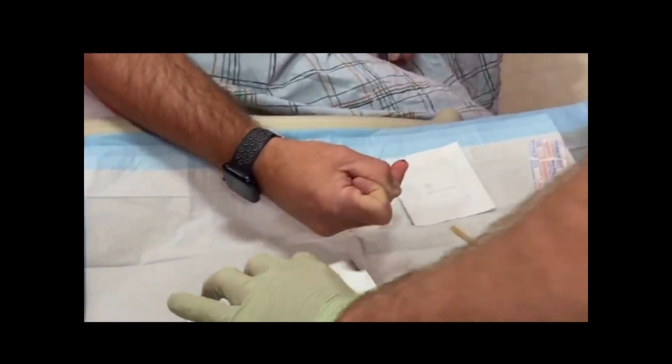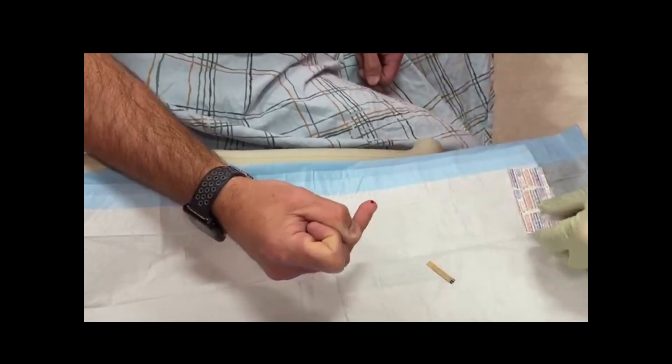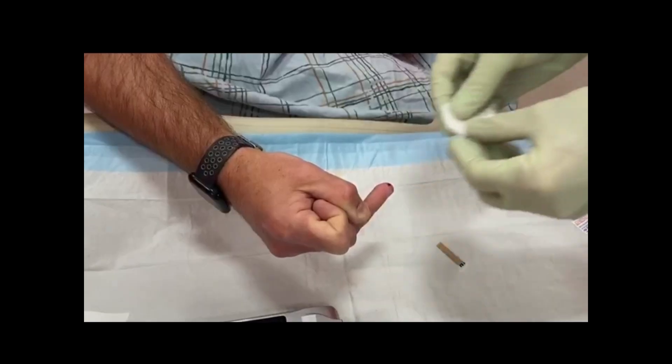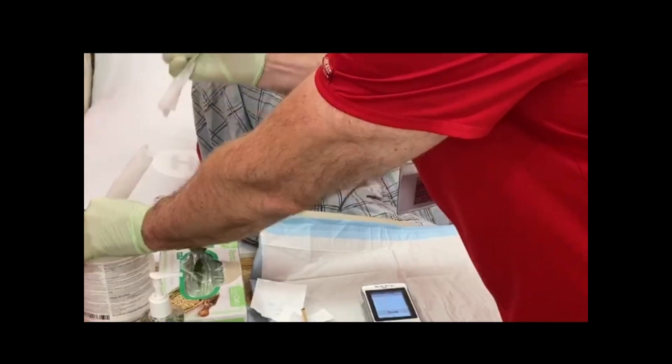Eject the test strip from the glucose meter and place the glucometer onto the dirty field. Place a gauze or band-aid over the puncture site. Dispose of the lancet into the sharps container. Remove gloves if necessary.